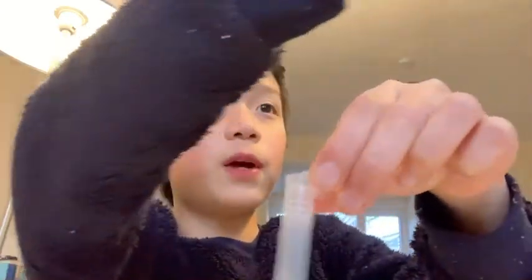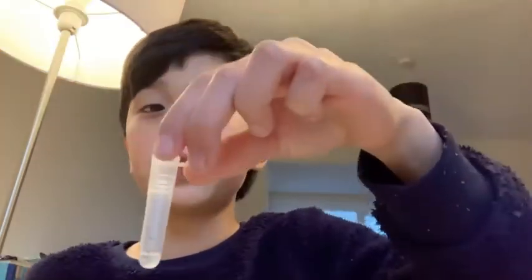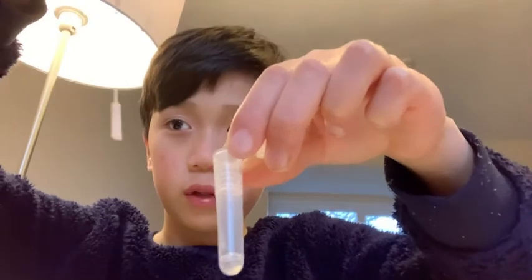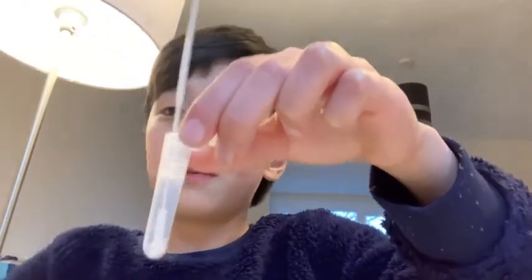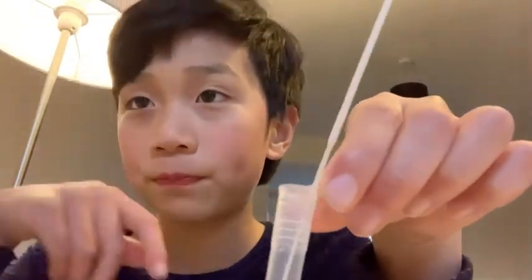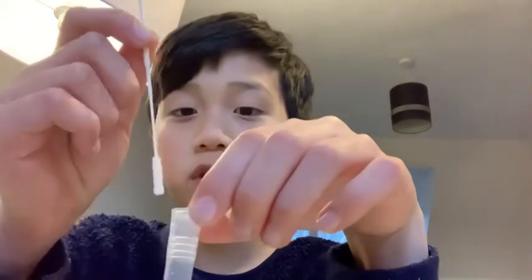There's this container that you also get from the pack, and there will be liquid in it. You put the stick into the liquid and hold it there for 15 seconds: five, four, three, two, one. Then you pull it out and put it aside.